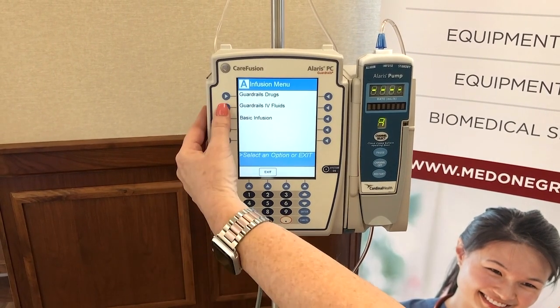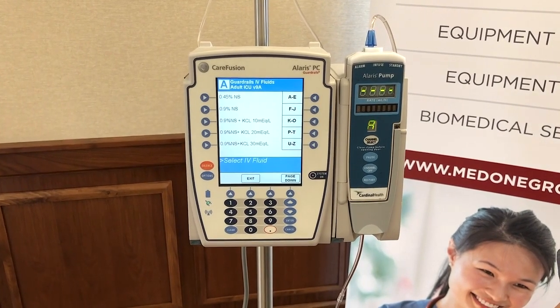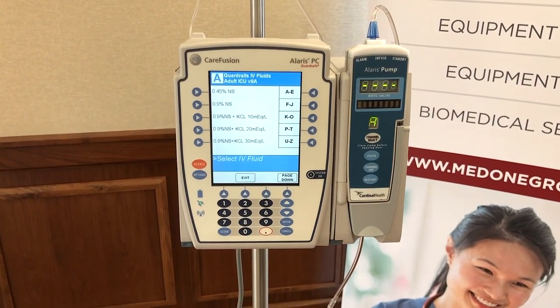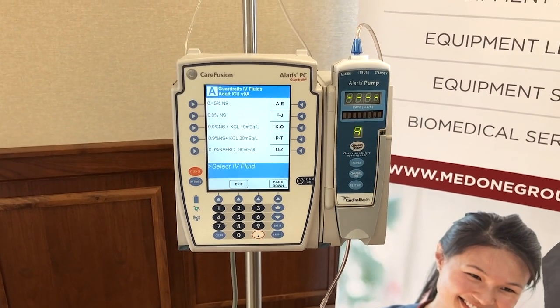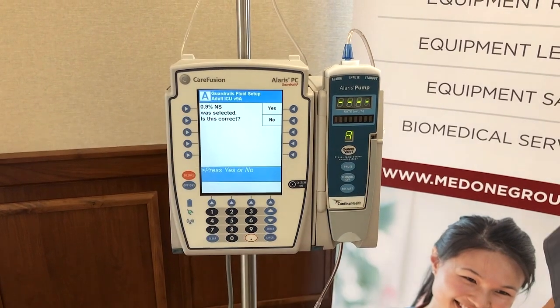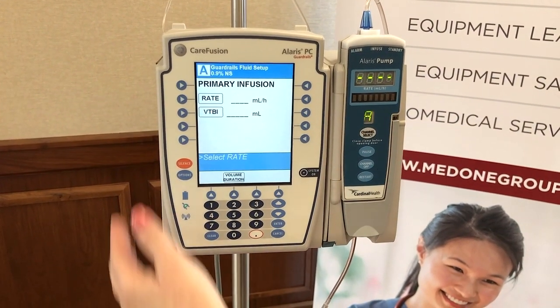We're going to start with a guardrail IV fluid. Again, this library is customizable based on what your pharmacy chooses to use. We're going to select normal saline — 0.9% normal saline — then say yes to confirm our selection, and then enter in our rate.